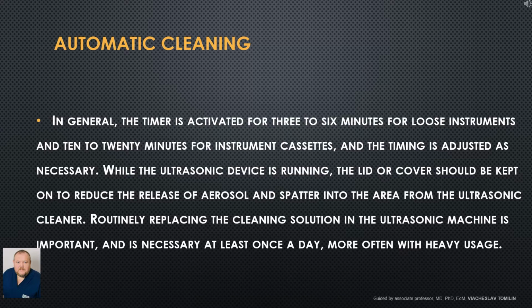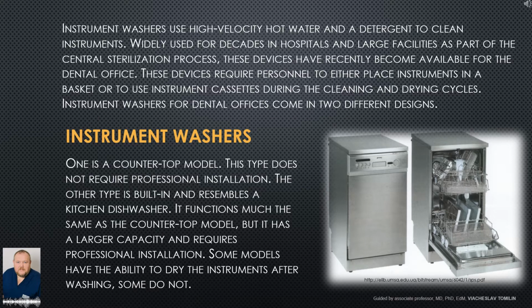While the ultrasonic device is running, the lid or cover should be kept on to reduce the release of aerosol and spatter into the area from the ultrasonic cleaner. Routinely replacing the cleaning solution in the ultrasonic machine is important, and is necessary at least once a day, more often with heavy usage. Instrument washers.